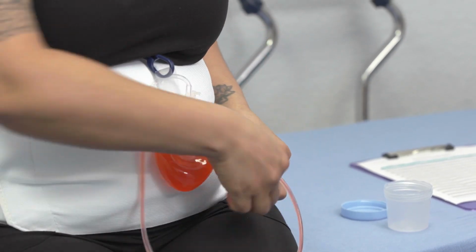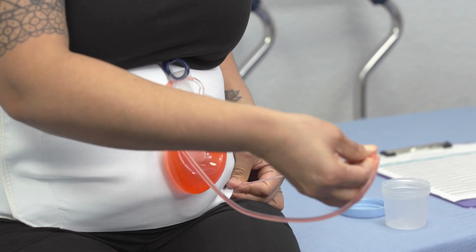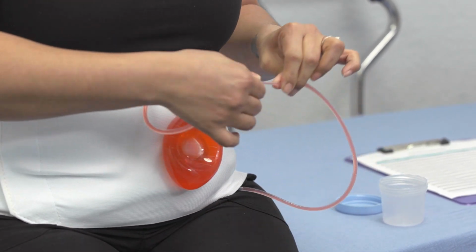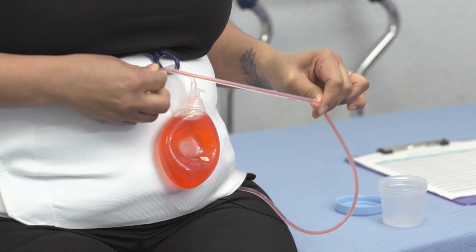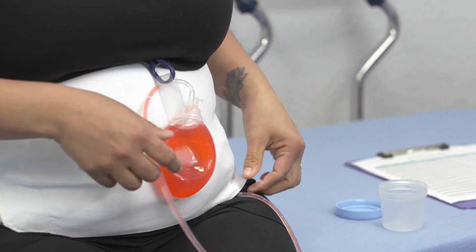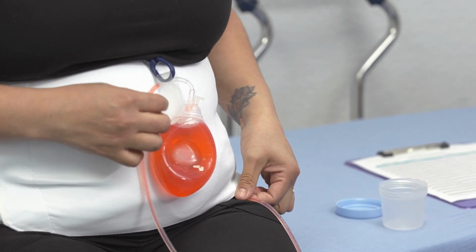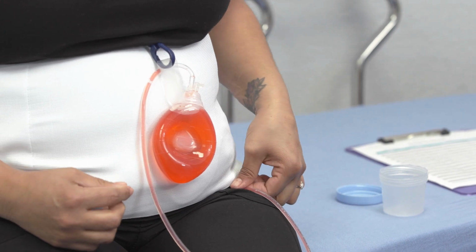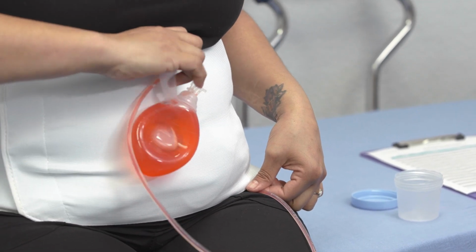You're gonna wanna do this 1 to 2 times each time you do it. And you're gonna wanna milk it at least twice a day. Recommend morning and evening before bed. However, you are only required to drain it once a day unless otherwise indicated by the amount of drainage you have after surgery.